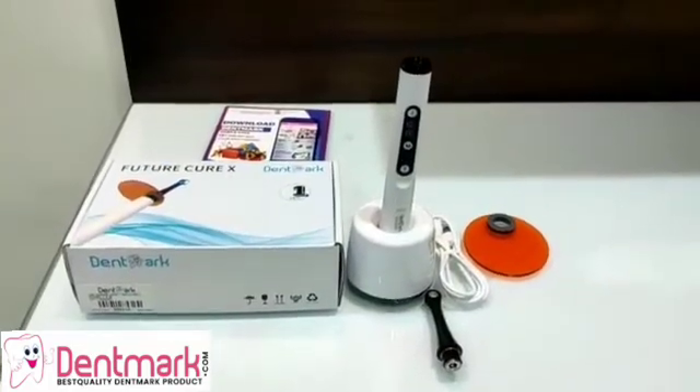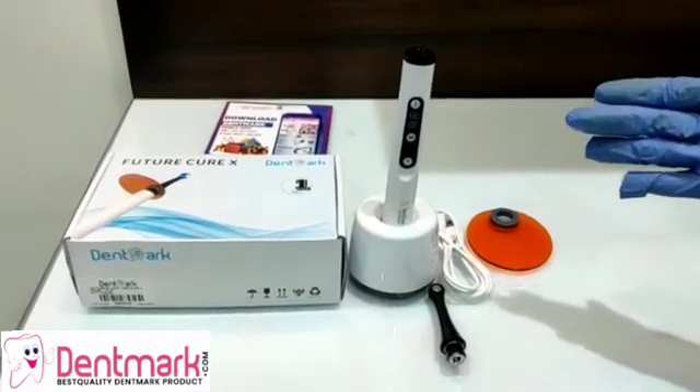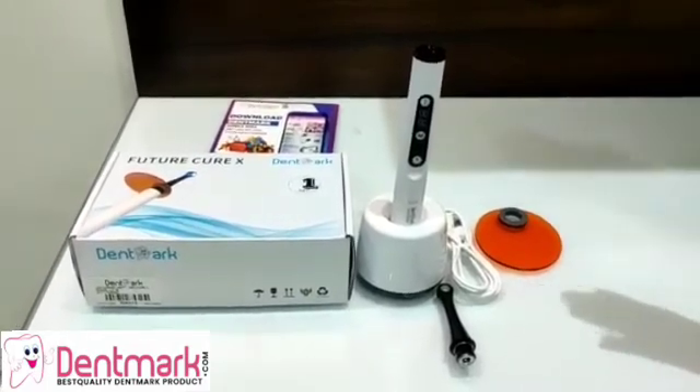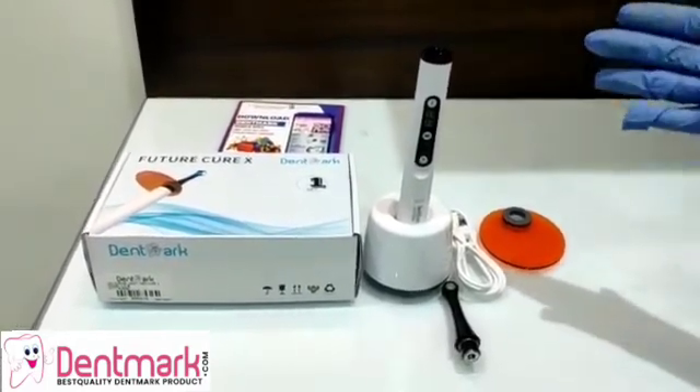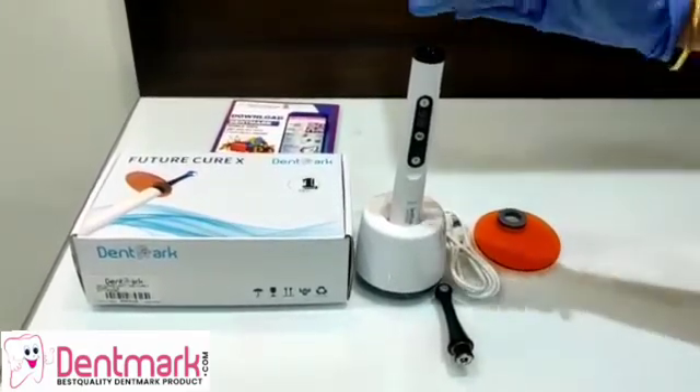Greetings, DentMark peers. Today we are going to watch a video on the DentMark equipment. This is a light curing equipment and this machine is called the LC-15.